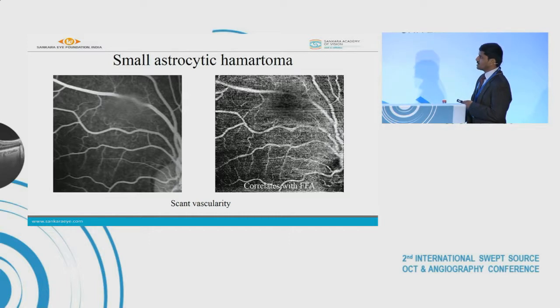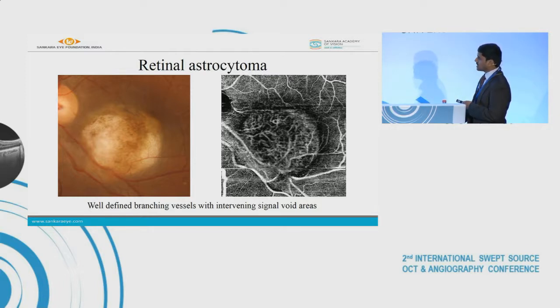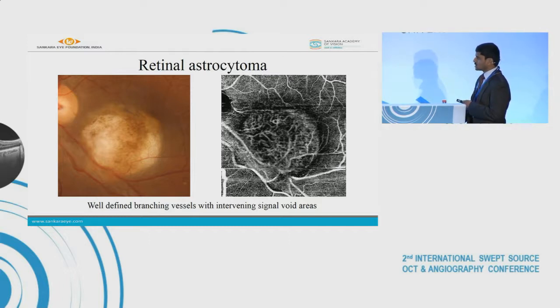In contrast to the small retinal astrocytoma, in this case we can see a large retinal astrocytoma which showed progressive growth over the last few years. On OCTA we can see abundant interconnected vascular network. The intervening signal void areas are more when compared to the vascular tumors because these tumors are solid.